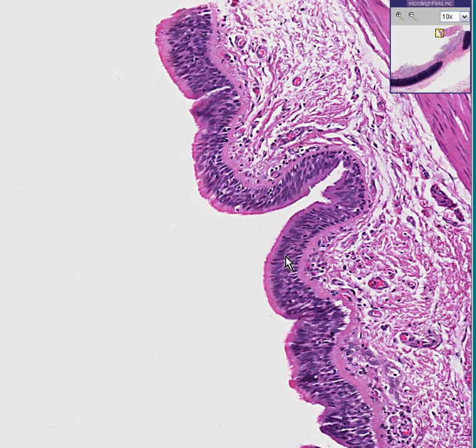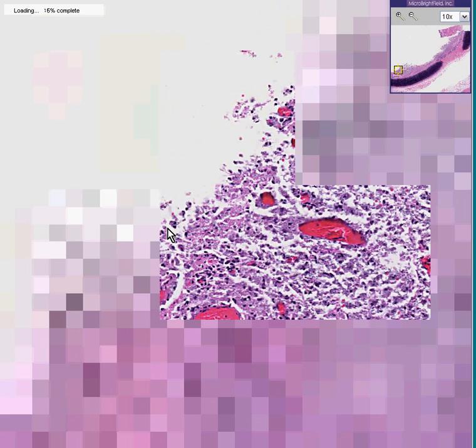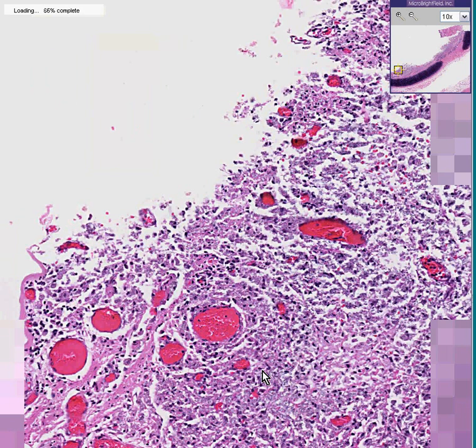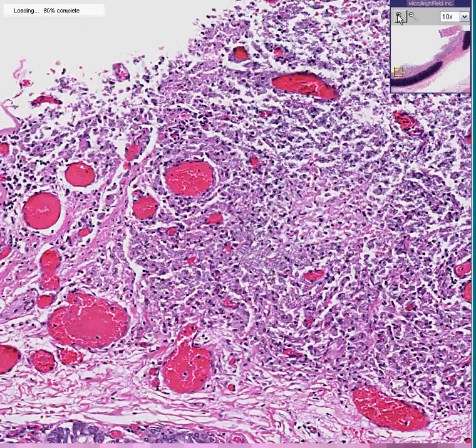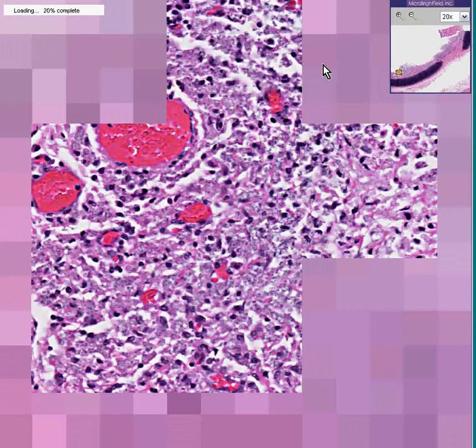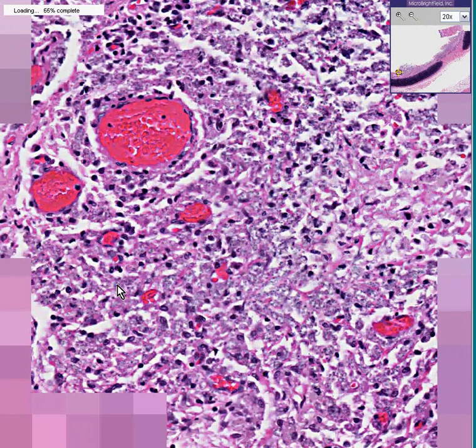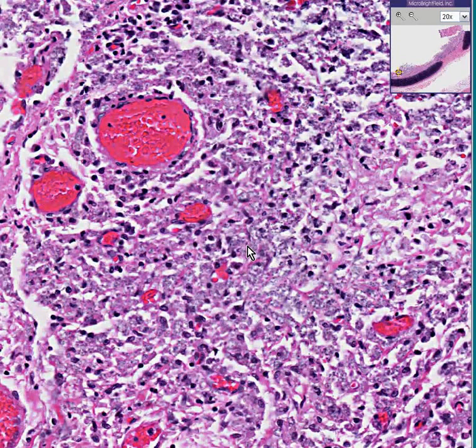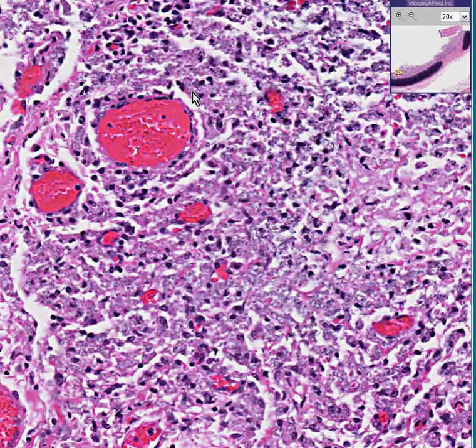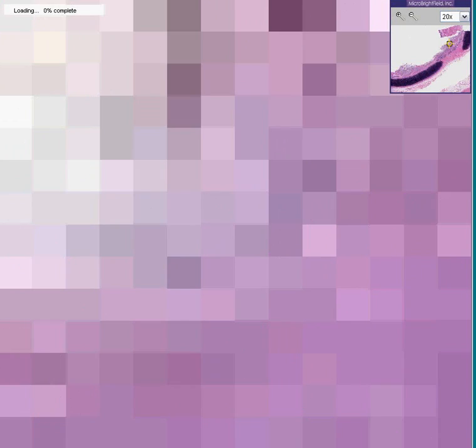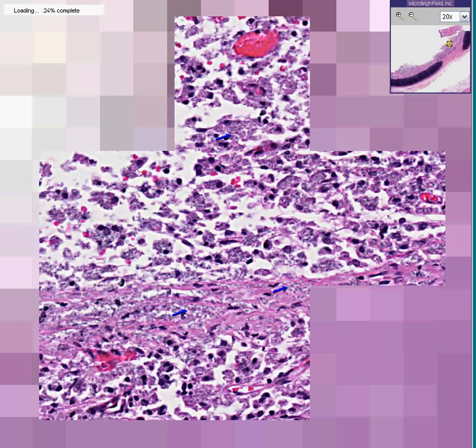This is your normal bronchial mucosa, but if you look in the parts of the mucosa replaced by this crud — and I'll admit I would probably miss this nine times out of ten — in some of these areas you could see tiny little, almost purplish structures surrounded by a little bit of pinker material. That could be anything at this level, but here's some here as well, and here's a few over here. Let me show you a much better example that somebody was nice enough to spend a long time looking for in this case.